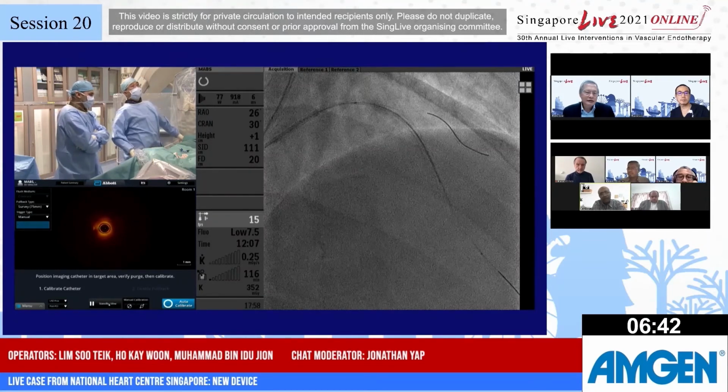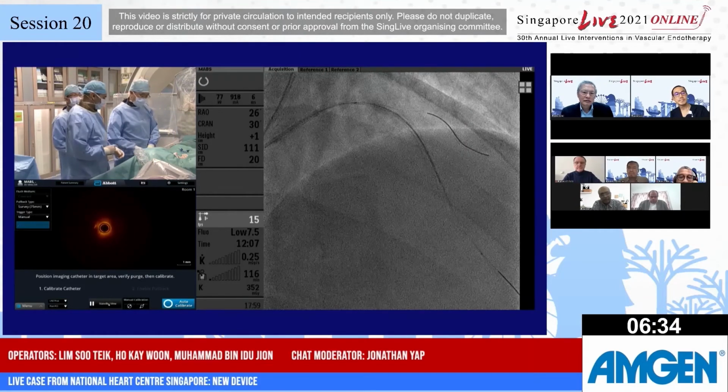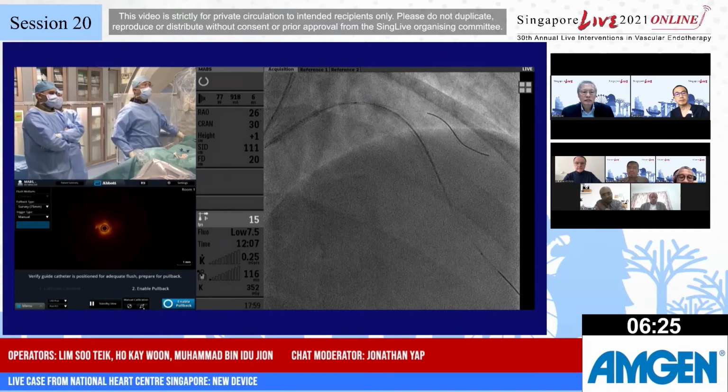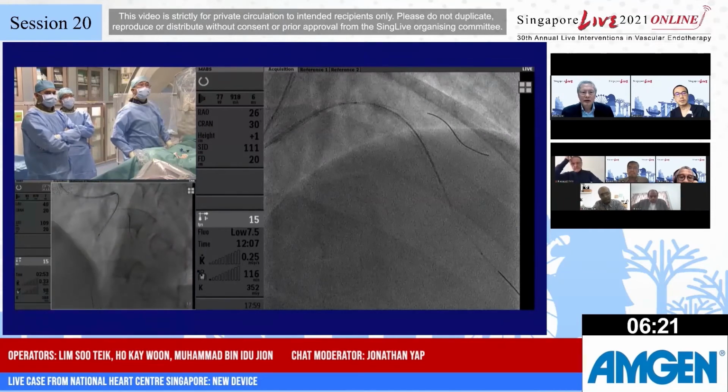Ready or not? Calibrate. I do a test. It's okay. Yeah, engage. Okay, we're ready. You enable pullback.